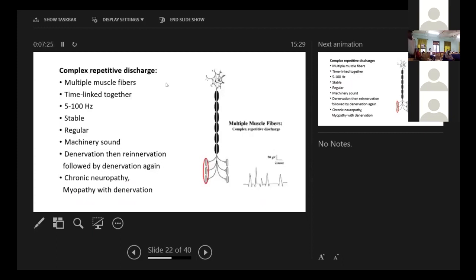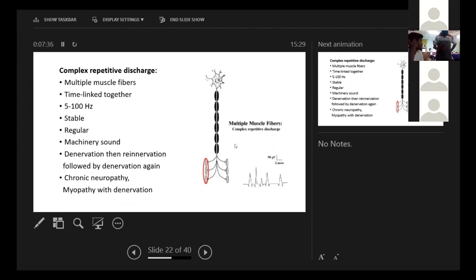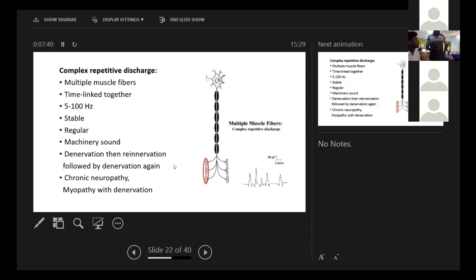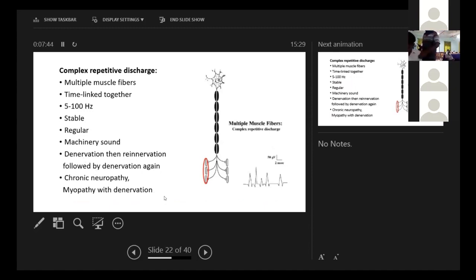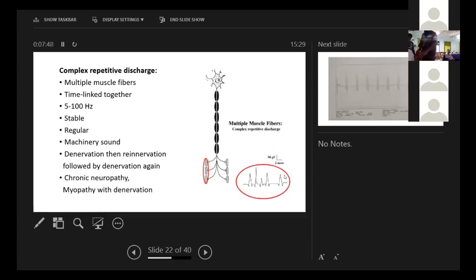This is another spontaneous activity, the complex repetitive discharge. It involves multiple muscle fibers. Previously, those were from single fibers. So this is multiple muscle. It gives a sound like machinery sound. It denotes denervation, then re-innervation, followed by denervation again. It is seen in chronic neuropathy or myopathy with denervation.